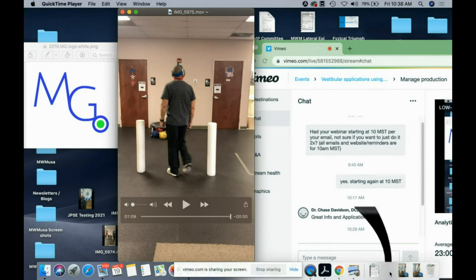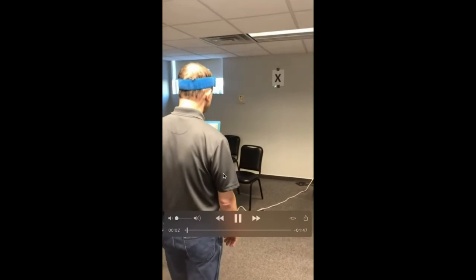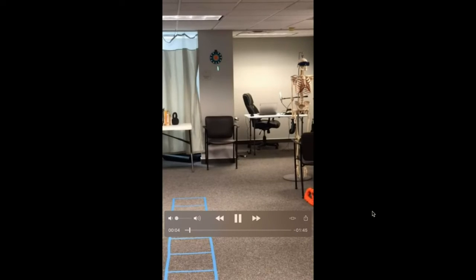And then let's take a look finally at this application. Now, this was posted with permission for this presentation today. This is a video sent in to us from a person who works a lot with Parkinsonian patients. And he just wanted to show us the different things that he's working on. I have a current patient right now who has orthostatic tremor. So she just, in resting, she starts to get tremor, but she doesn't have the same presentation or the same diagnostics as Parkinsonianism. So if we look at this particular video, this person has Parkinson's as a diagnosis.